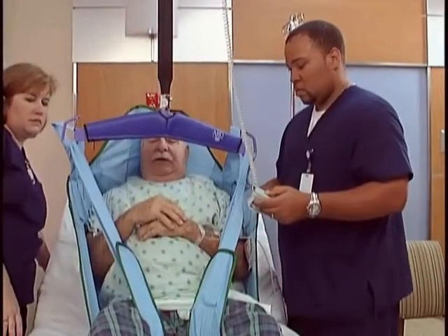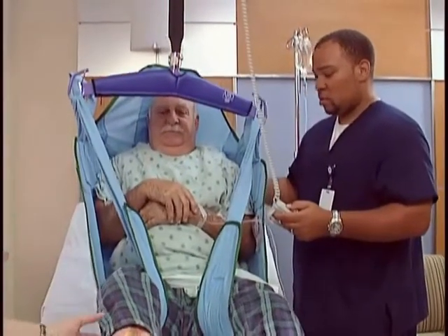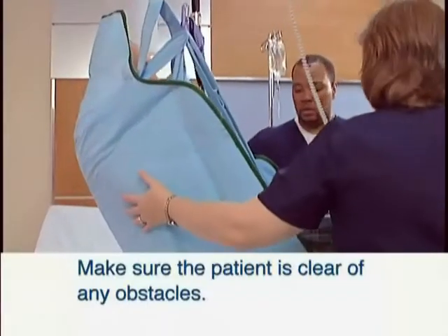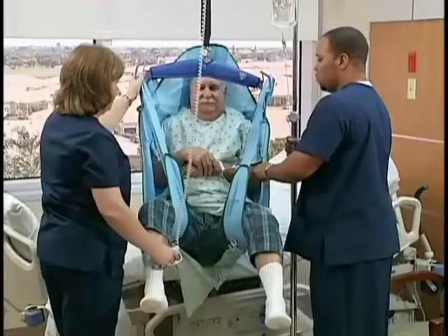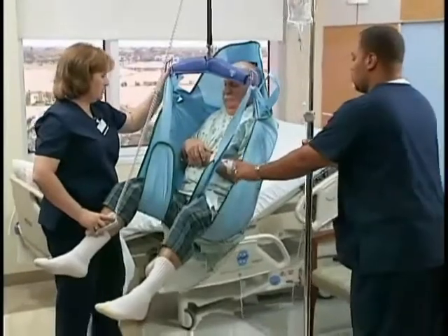Carefully observe the patient to ensure his or her safety as you press the control buttons and raise the patient. Make sure the patient is clear of any obstacles before moving. Guide the legs if necessary. When the patient is located above the desired point of transfer, press the down button.